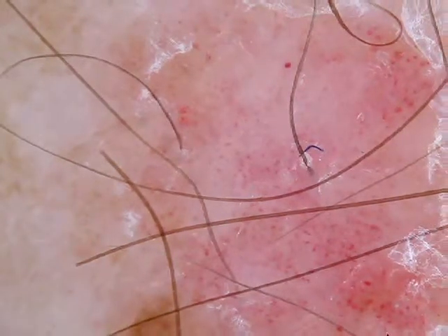Dermatoscopy, we see again dotted vessels here and here and here, but there are also some larger dots that may be coils. So we have a polymorphous vascular pattern. Sometimes it's difficult to differentiate between coils and dots, but what is not so difficult is that the vessels here are arranged specifically. We can see clusters.